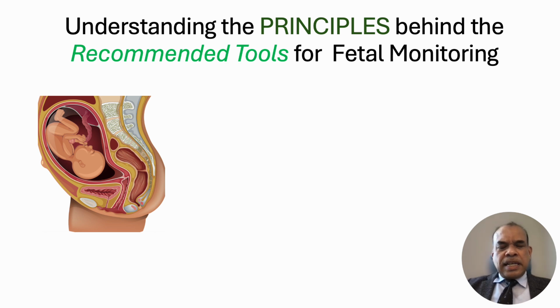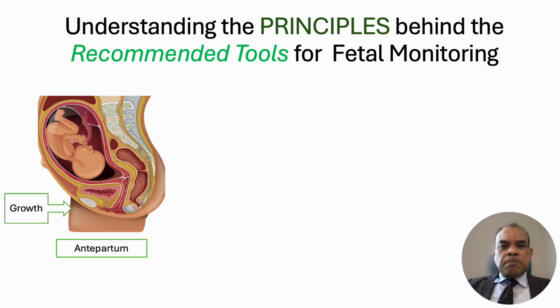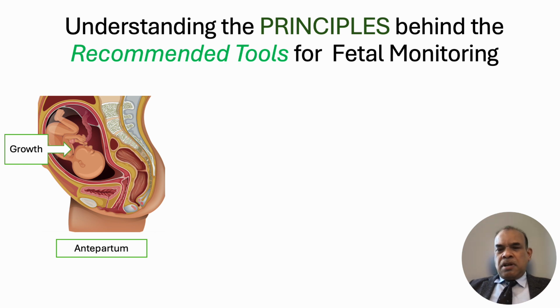So let's just take a step back and look at the principles behind these tools. If you are considering the antepartum period, it's a long period of approximately 9 months. And therefore, we have to assess fetal growth.